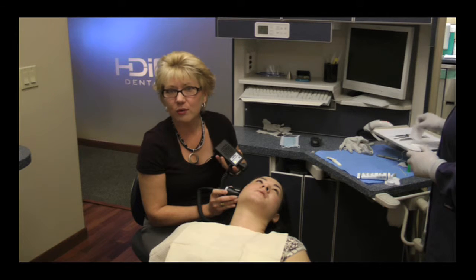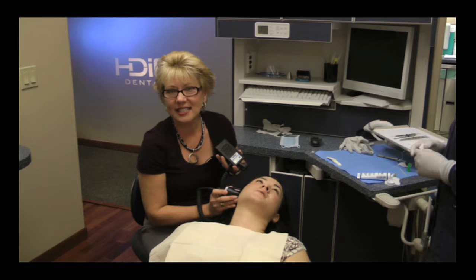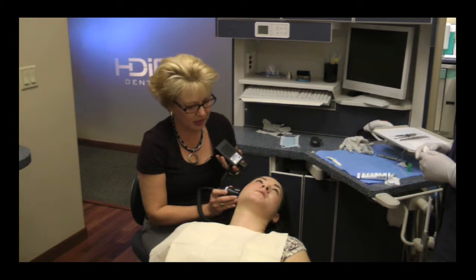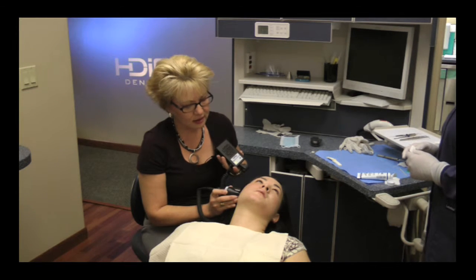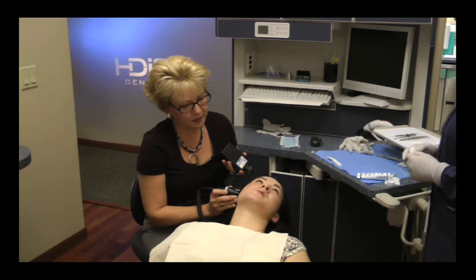Another way to isolate rotation would be to have her do a working side movement. So I could ask Katie to move her jaw toward me. So Katie, now go slowly, about a second over to the right, and back. And over to the right, and back. One more time, and back.